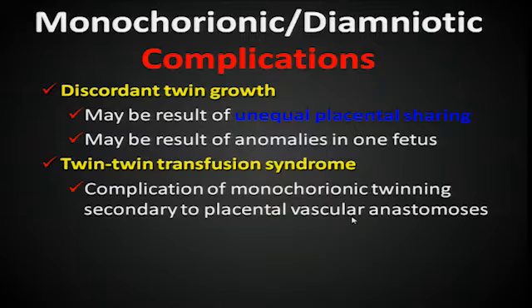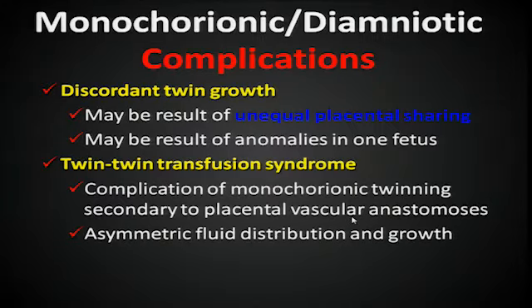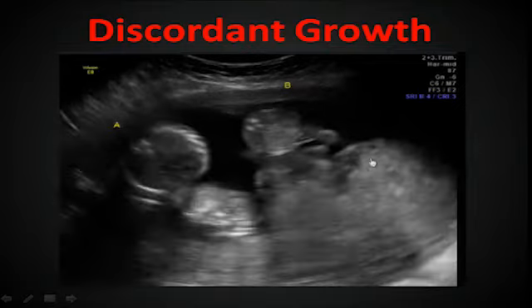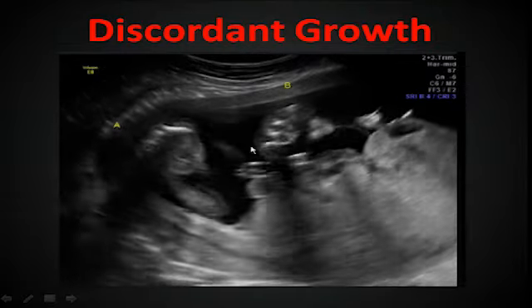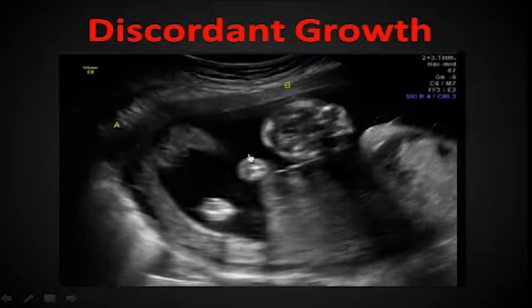So one baby has very low fluid, and the other one has too much volume, too much blood. So it's trying to get rid of some of this, so it ends up with polyhydramnios. You have asymmetric fluid distribution and growth. And just looking at this, this is baby A, this is baby B. Just from looking at this, you can see the size difference between these two.